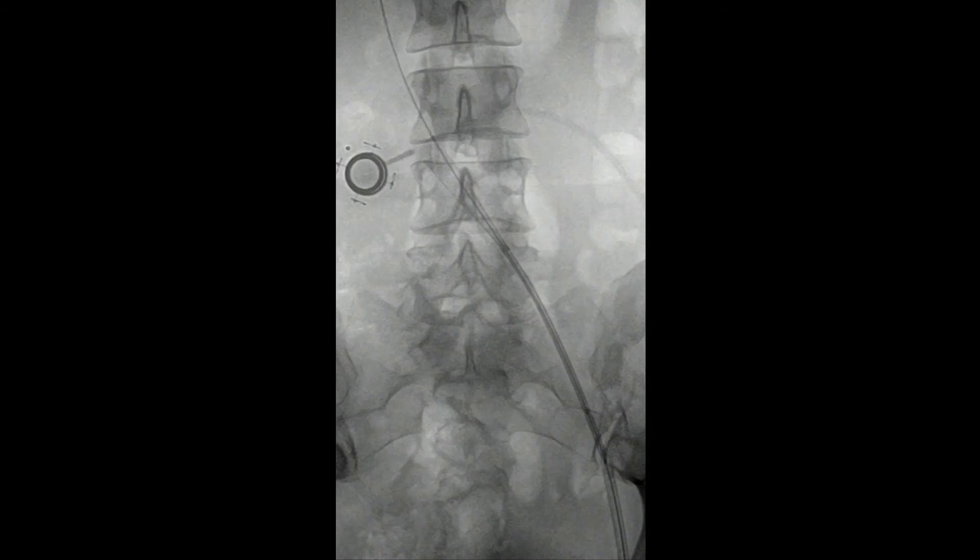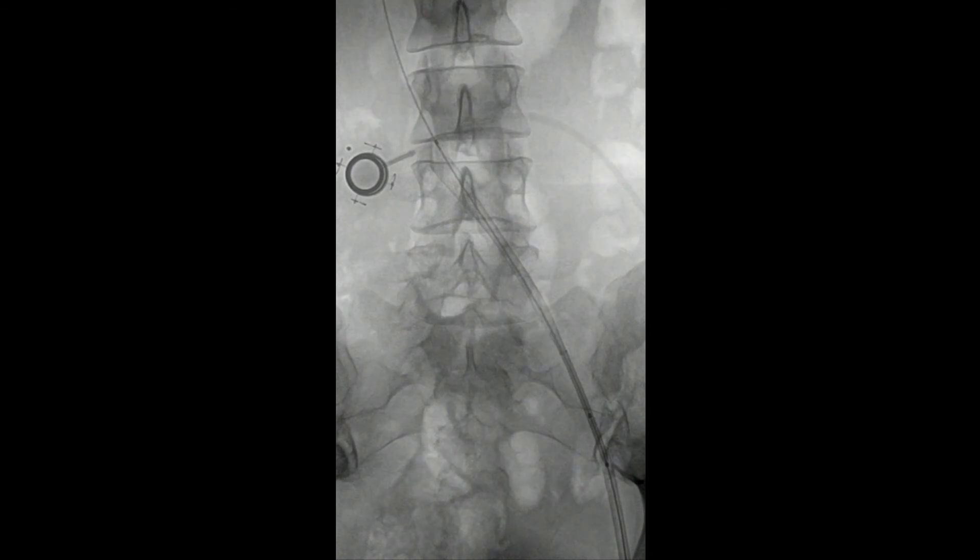Once the stent has been deployed, you can see it was still fairly compressed, and we opted to go ahead and balloon this — of course, we'd always planned to balloon this. You've got to be really careful as you bring the balloon up that you don't catch on the back end of the wall stent. That's one of the reasons for using a long wall stent: with a short wall stent it is possible to catch your balloon on the back end and displace the wall stent up into the inferior vena cava.